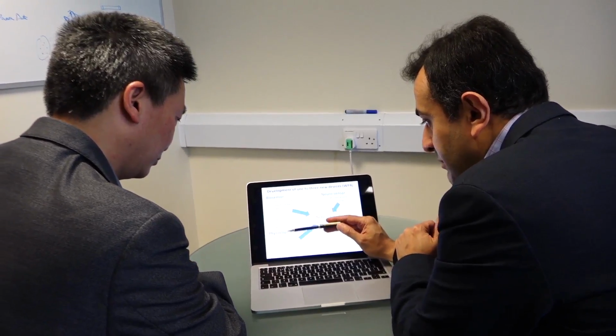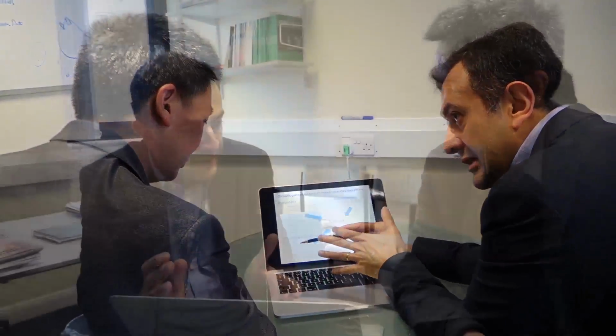One indicator of deterioration in liver function is the development of jaundice. That is the yellow coloration of the skin and the eyes, which at the moment we have crude measures for, either looking at it clinically or through blood tests. It would be very useful to be able to measure this in the community, ideally before a patient deteriorates, so we can pick up an early sign of deterioration and intervene early, when the costs are low and the requirement for hospitalization is negated.